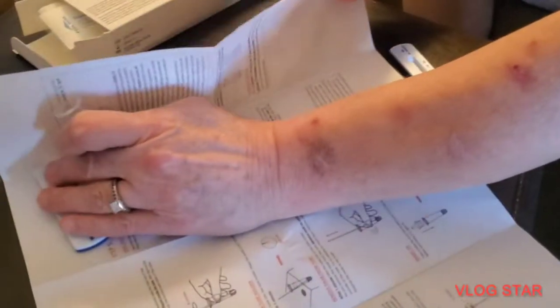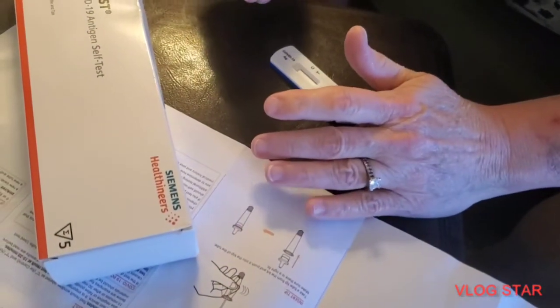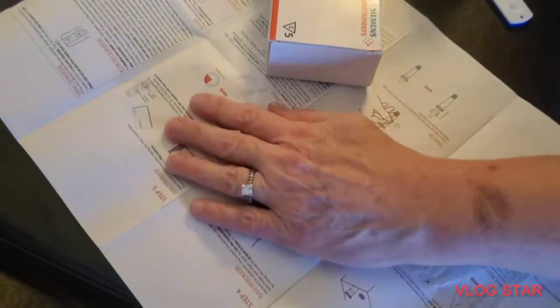Where is it? The lid. Grab it. Make sure it's on a flat surface. It's on the floor. Take a tube tip from the kit. Open the test device.